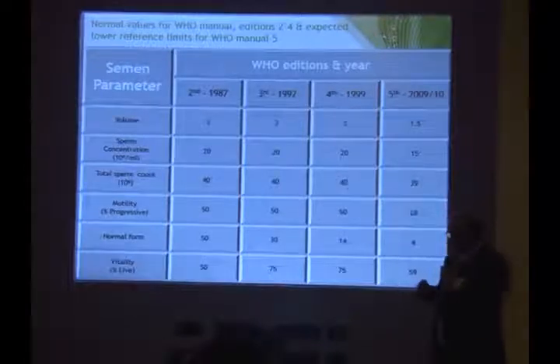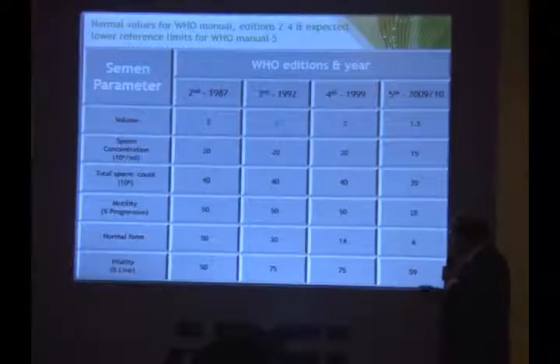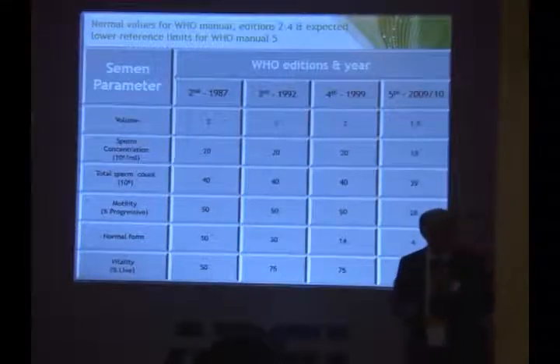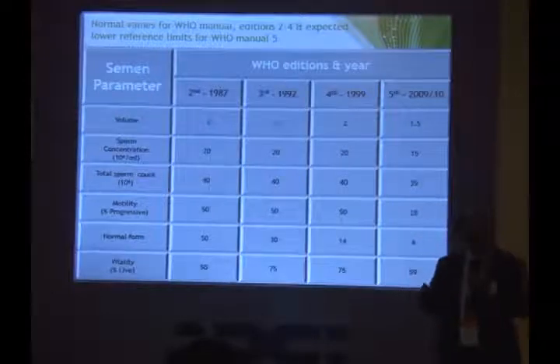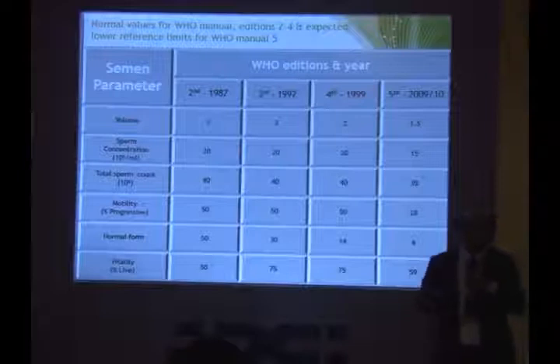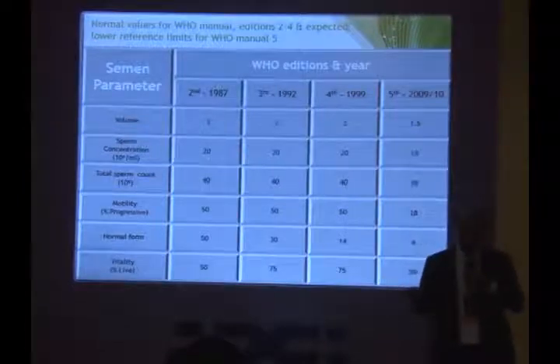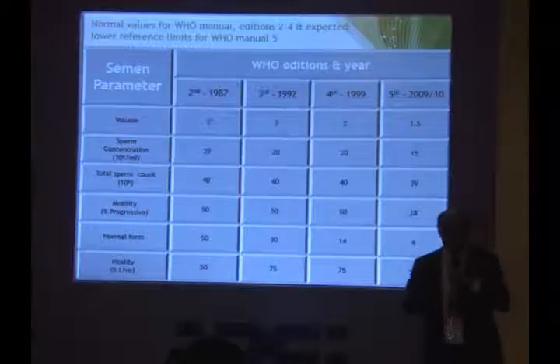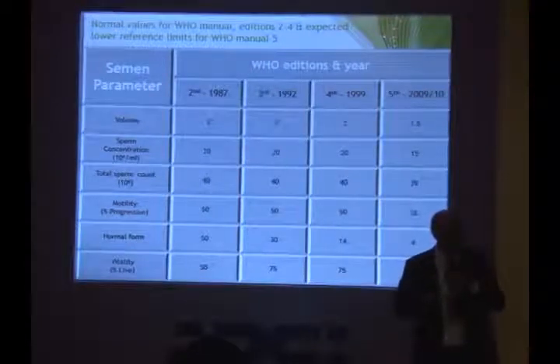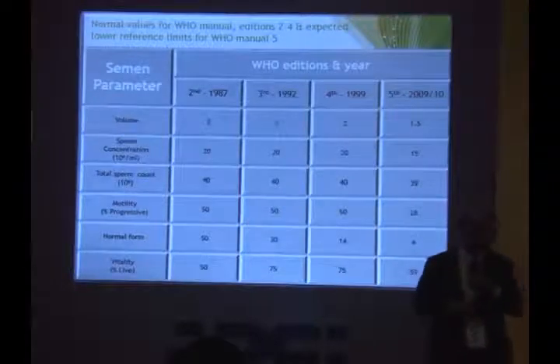Now somebody asked me what viability is, whether there is any difference between motility and viability, and in which situations it is important. We will address it, but yes, sperms can be non-motile but viable. In other words, one can even have 10% motility and 50% viability. If I do viability tests, there are different types of tests. One is the eosin-nigrosin assay, there is a hypoosmotic swelling test, there is a mitochondrial membrane potential test.